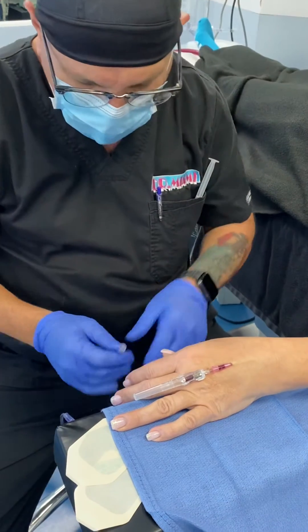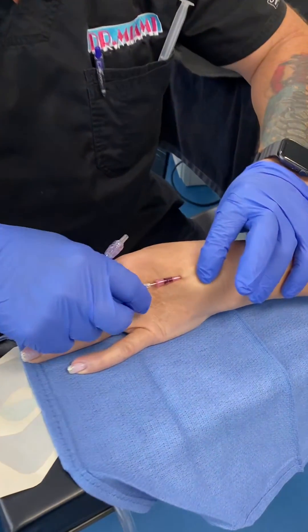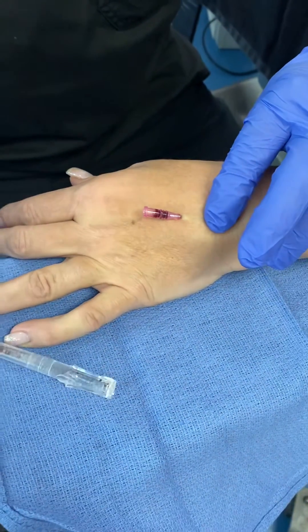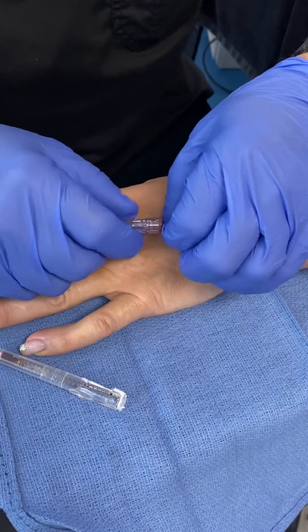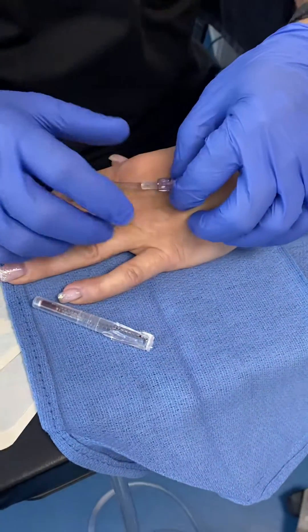Now I've already taken off the cap, and I'm going to put pressure here just like that and pull out. Look at that — no blood, not a drop. Put this in, lock it down.